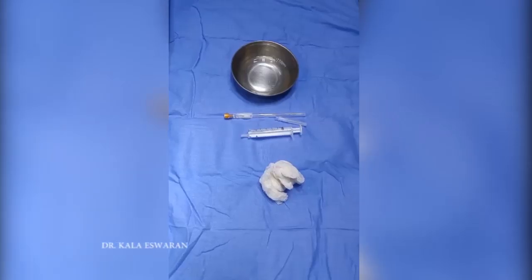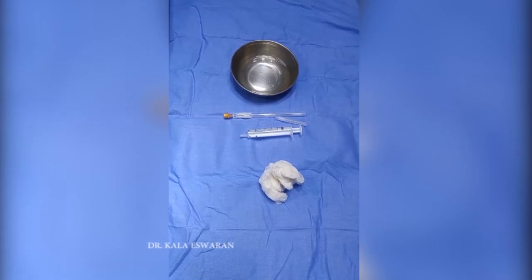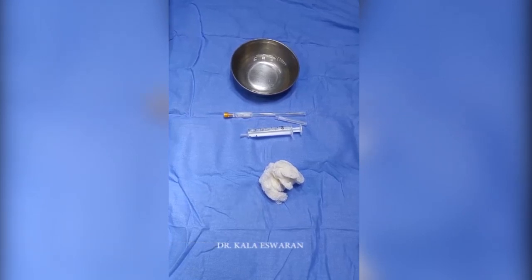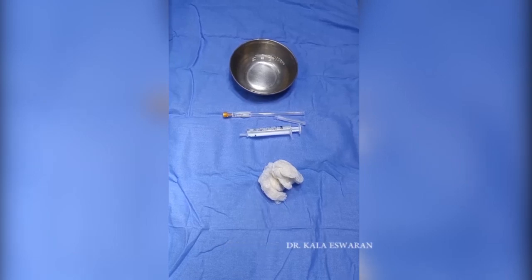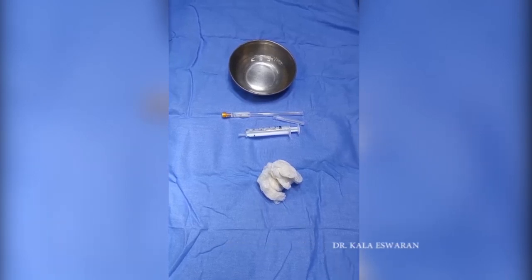I am painting here with betadine and then later spirit. The bowl contains the local anesthetic agent to be used: it is a mixture of 20 ml of 0.5% bupivacaine and 20 ml of 2% adrenaline xylocaine.